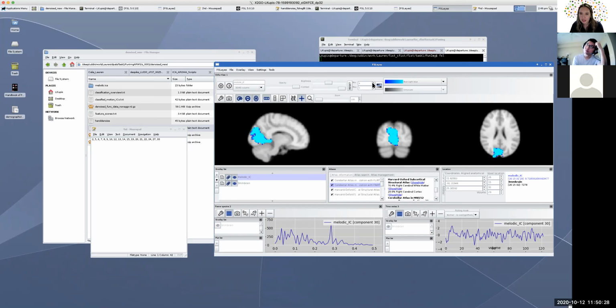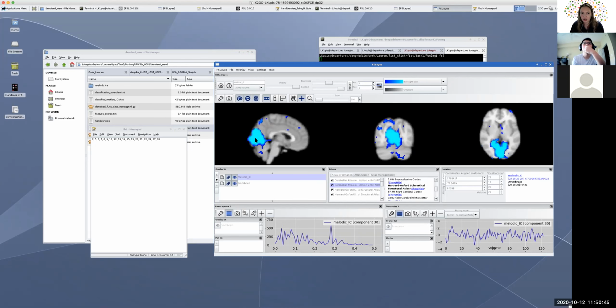So this one's kind of mixed because it has a little bit of white matter and cortex, and it has some in the lower frequency region, but it does have a peak over here. The time series, nothing too concerning. So with that, because it is mixed, again, you want to err on the safe side. So I would leave this one in for 29.